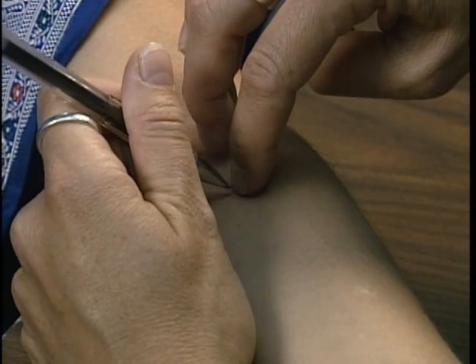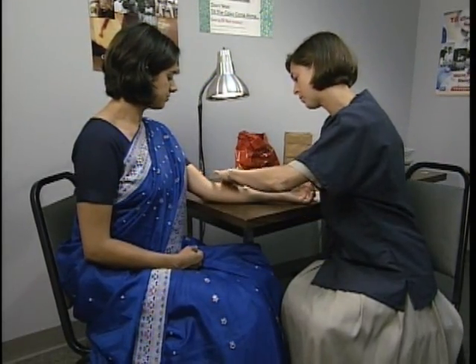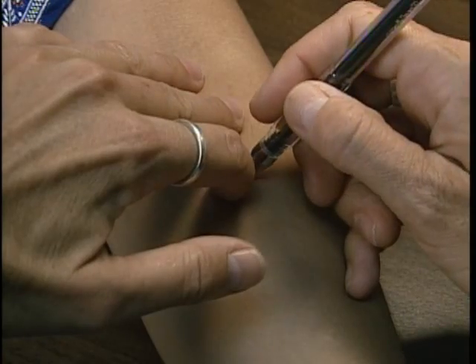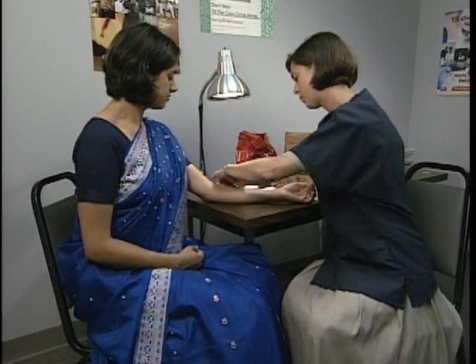Mark lightly with a fine dot at the widest edge of the induration, using the fingertip as a guide. Repeat the procedure from the other side of the patient's forearm and place the second mark on the margin of induration. Palpate again to double-check that the induration was marked correctly.